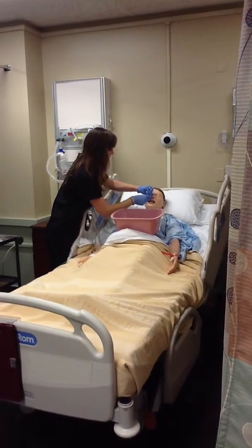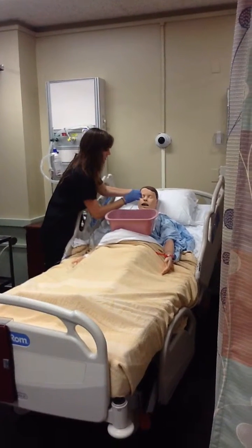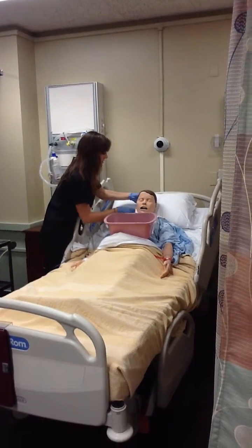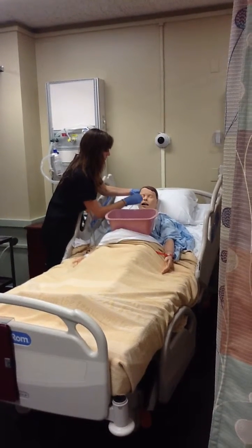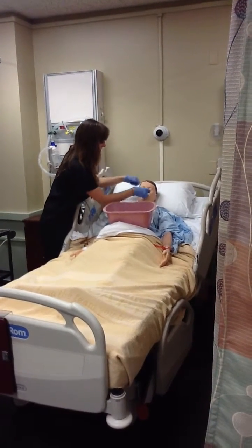All right, remember to tilt your head back. And now I'm going to need you to tilt your head forward. And swallow, swallow, swallow — and one last big one, swallow. Perfect.